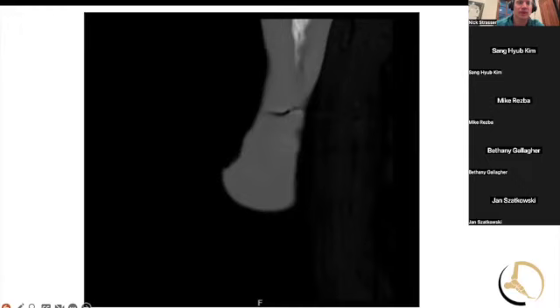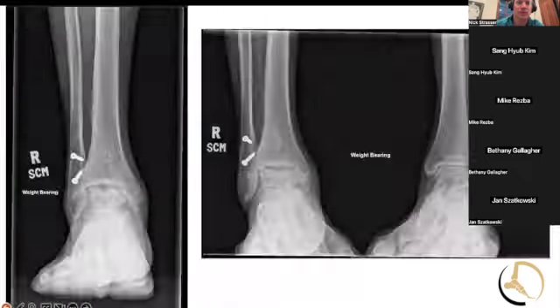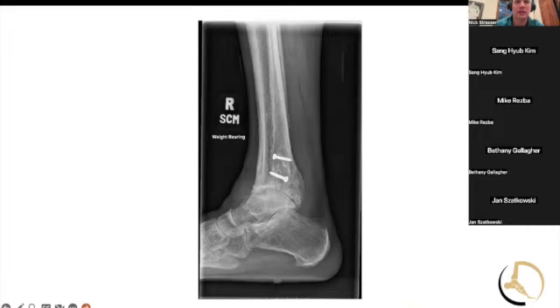I'm going to go back to the X-rays. Lateral. Yeah, that was my thought too, to go from the back. I didn't really want to go from the front. I didn't think a lateral approach was very good because I was concerned about the skin. Maybe if I took the fibula out, it would have been okay. I don't know. But all those thoughts.